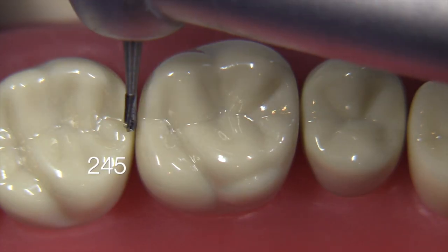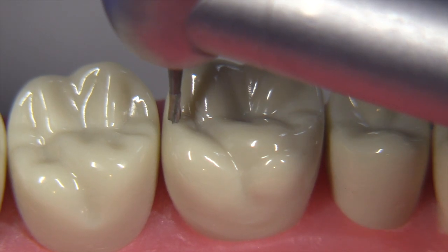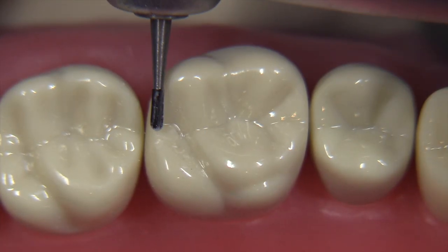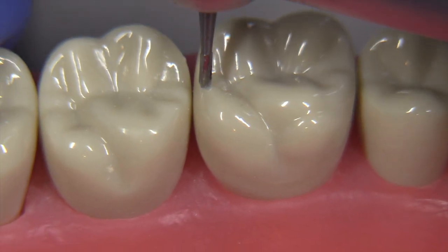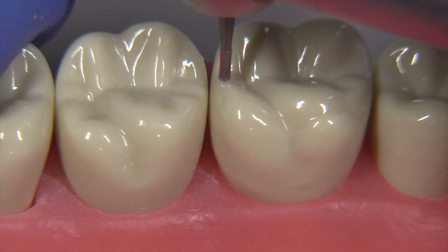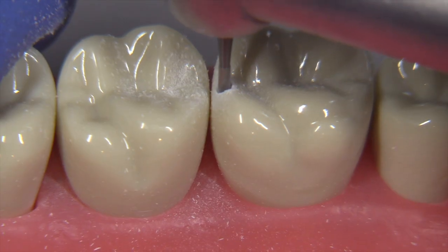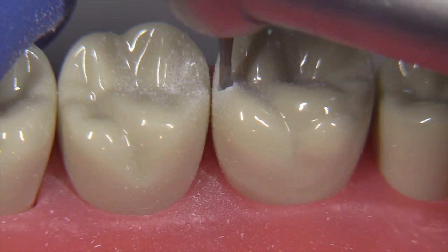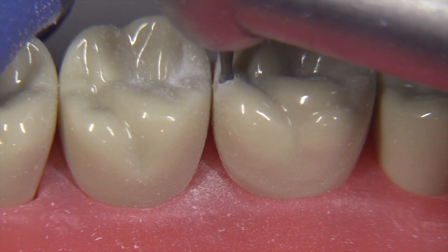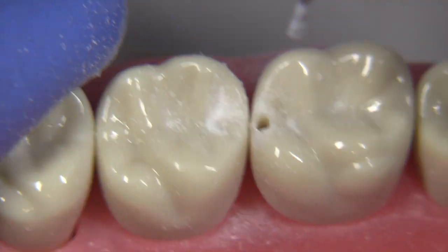Let's start with the box. I like to start with boxes whenever I have an unknown outline form - when I'm not really sure what the outline form should look like, the box first really makes sense. Then we can develop the occlusal portion to provide us with the ideal retention while following the grooves that are present on the occlusal. The 245 bur is excellent for this.